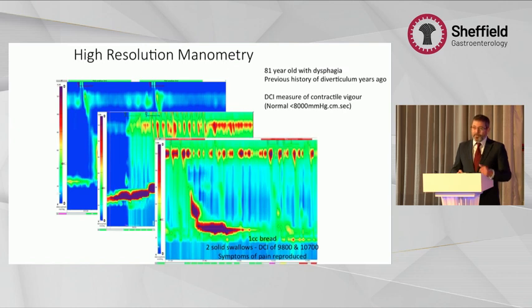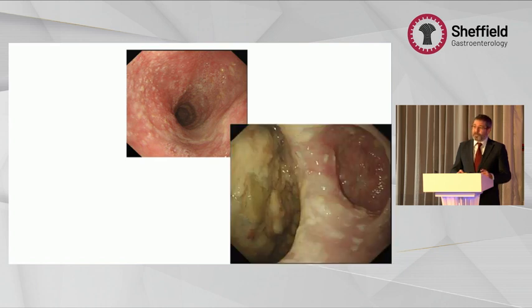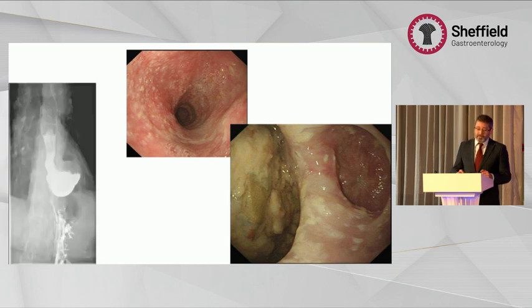And so I brought her in for endoscopy, went down, first mid-esophagus, well, there's a bit of candida there. As I progressed, you can see this is not going to be treated with Botox. On the left, you've got a massive diverticulum. On the right is, in fact, the lower esophageal sphincter, which is obstructed by the big diverticulum. And you can see this here. So had we done endoscopy or barium swallow in advance, then we would appreciate that this is not a physiology pathology.